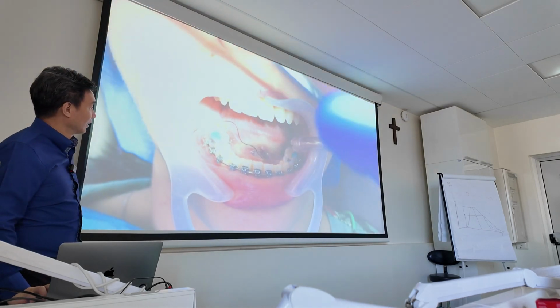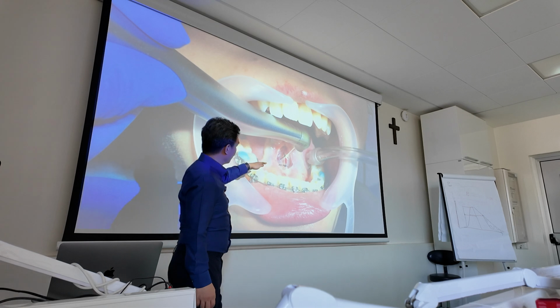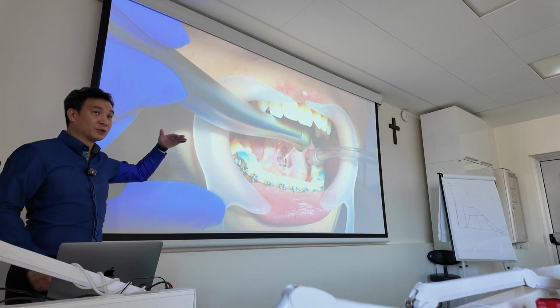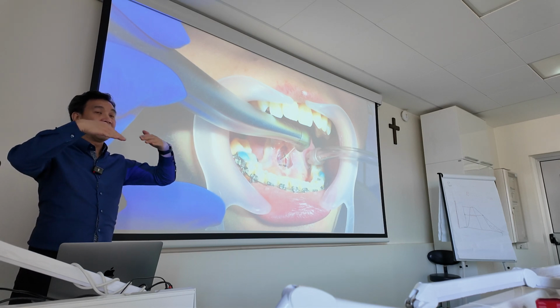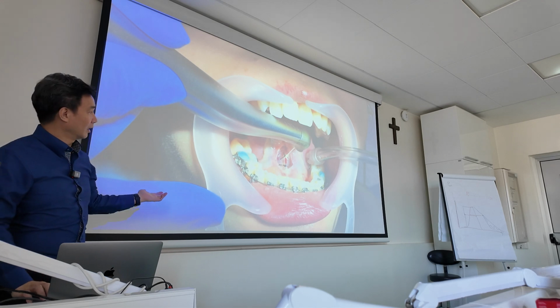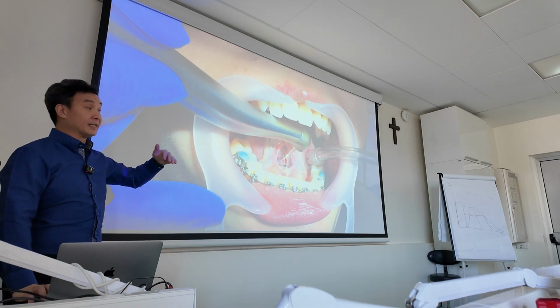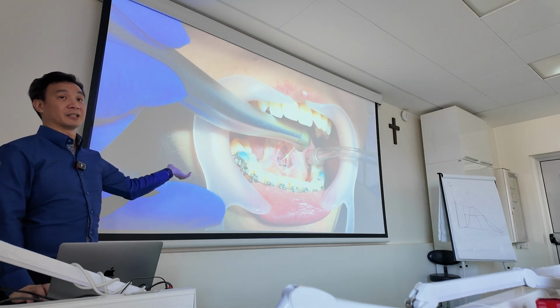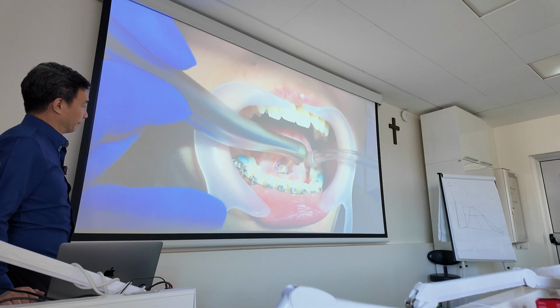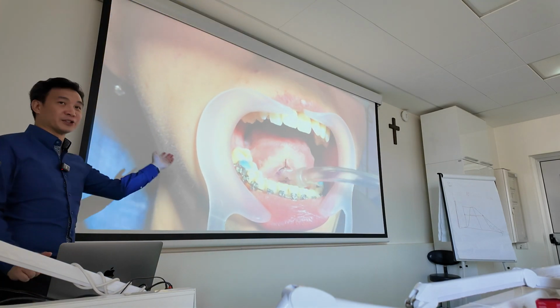So just cut through. Sometimes after this ligation, you're not too worried really. You can continue to attend to the rest of the fascia, cutting it through until you hit the genioglossal. Alright? And then I might want to leave it to the end because even sometimes through this ligation, there's still some bleeding. Alright? And you cut through, bang. Nice. Okay. So no bleeding, continue.